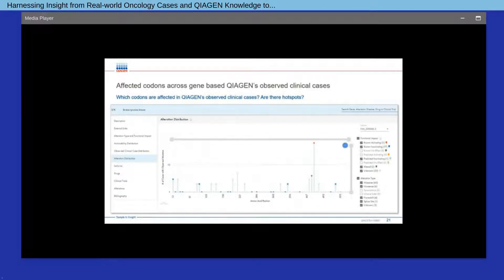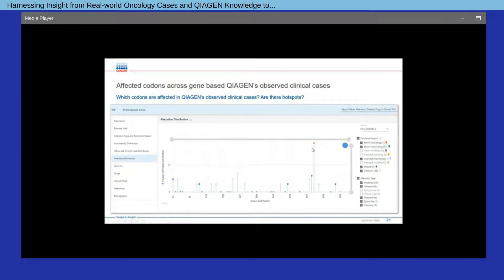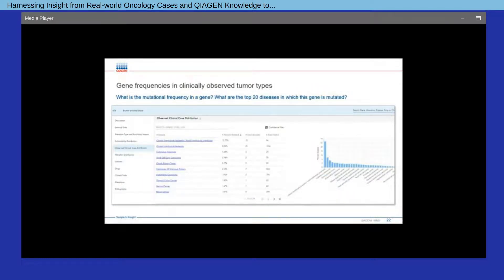What are the affected codons in a gene of interest where mutations occur — are there any hotspots? HSMD displays a lollipop graphic that allows you to identify where in the gene and how often we have observed clinical cases with a specific mutation at that codon. Hovering over the lollipop lets you determine the amino acid position for this hotspot. You may also want to review in which diseases BTK is predominantly mutated — in this example, CLL and CLL/SLL shows up as the top disease.